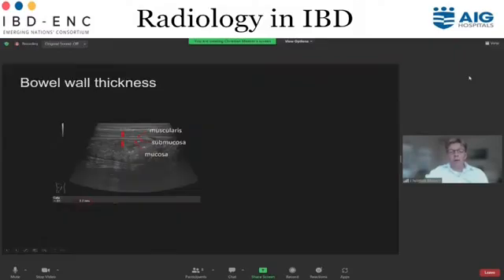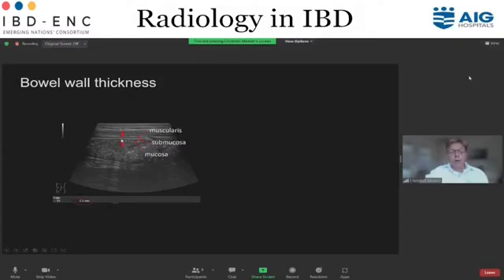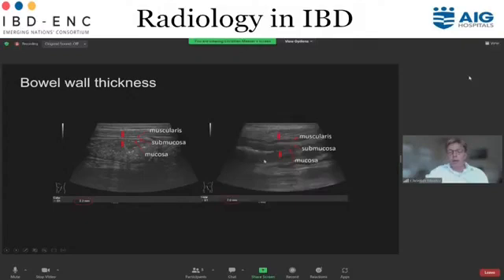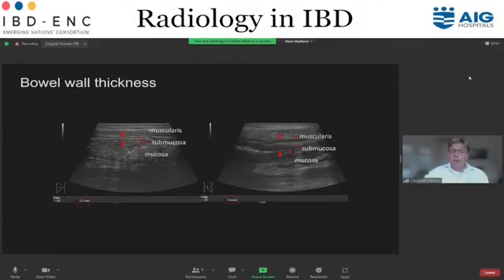The most important parameter in all clinical trials is bowel wall thickness. You can see the probe up here and then the three layers: the intestinal lumen, the black layer which is the mucosa, white submucosa, and muscularis — that's 2.2 millimeters, which is normal. Then in an inflamed Crohn's disease patient you see air in the lumen, black mucosa, white submucosa, muscularis — that's 7 millimeters. That's severely thickened, and I think every one of you can see the difference.